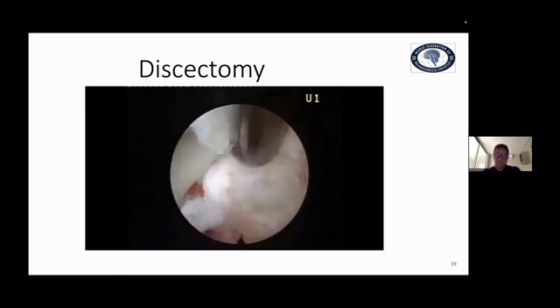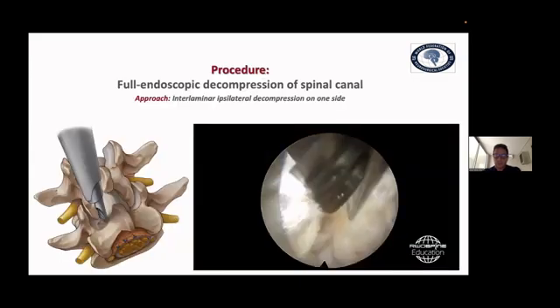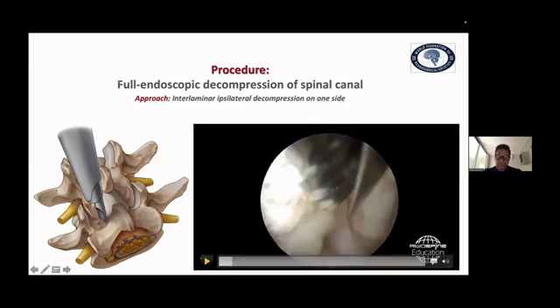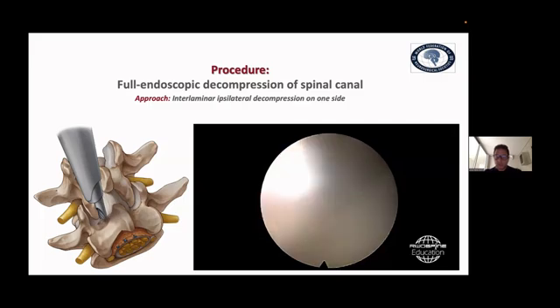But if we want to perform disc herniation surgeries at higher levels, or when we want to treat spinal stenosis, then we will use a drill in order to drill the facet joint and to make the over-the-top decompression. That is needed also.